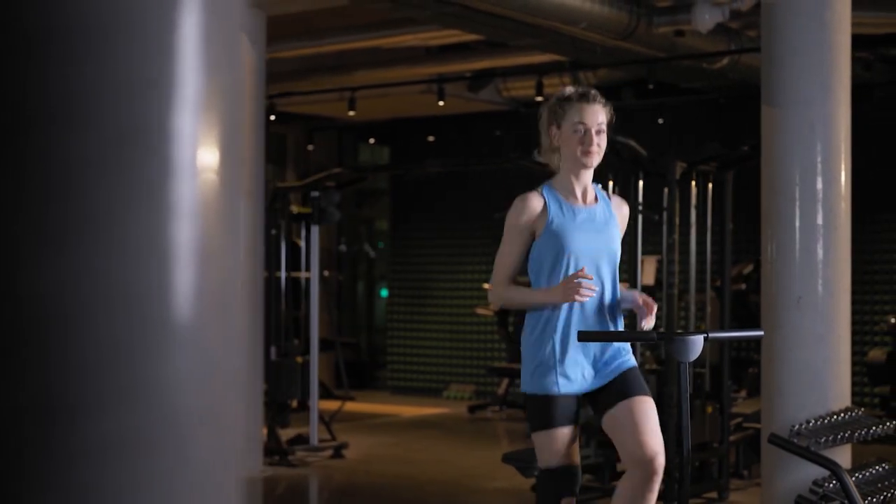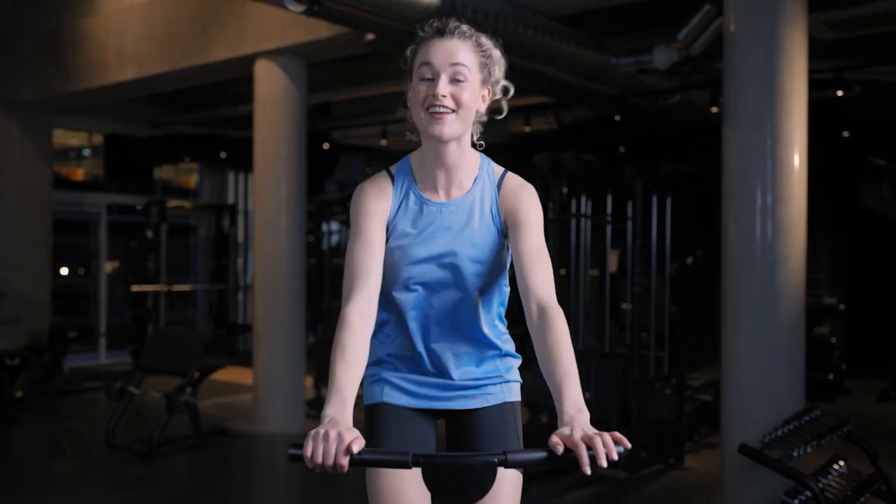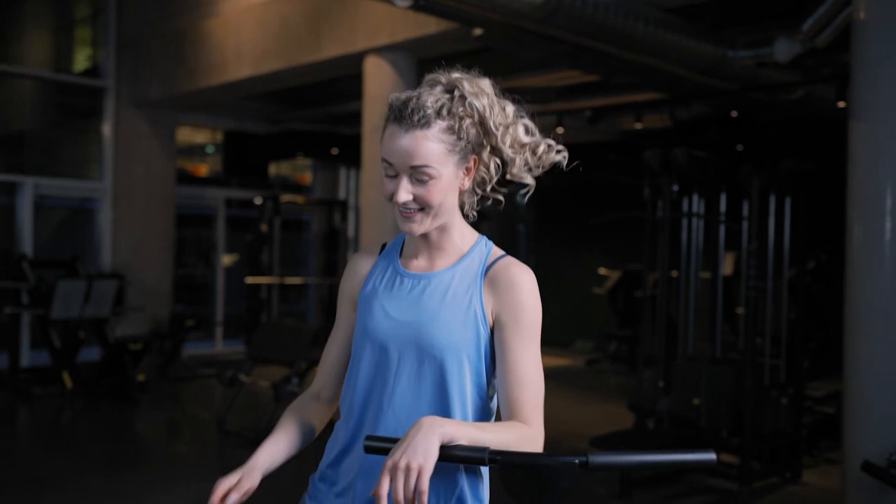Even after my knee trouble, I'm really happy that I can still exercise. I was feeling pain around the kneecap, even behind it sometimes.